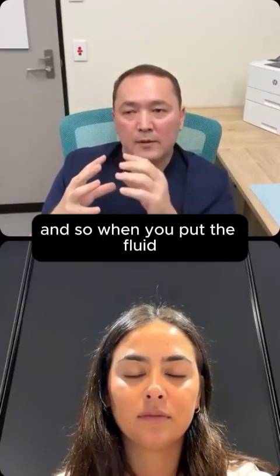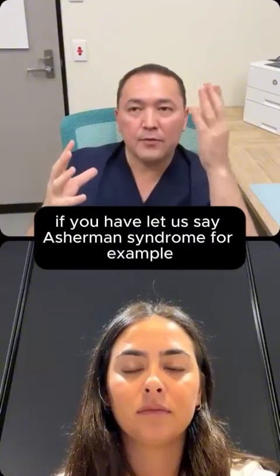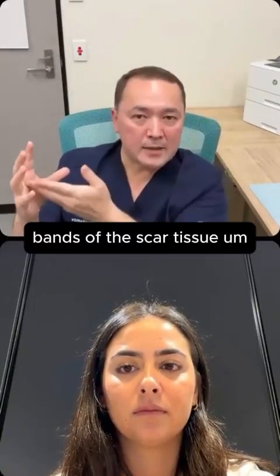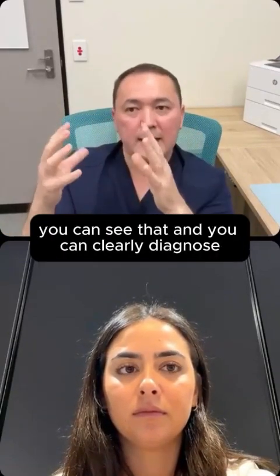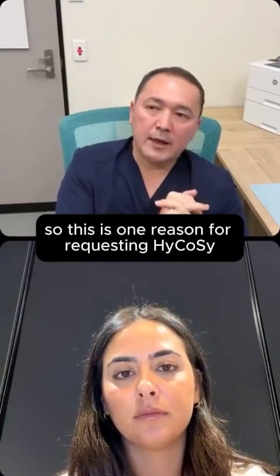So when you put the catheter and put the fluid in, you can see the cavity. If you have, let us say, Asherman syndrome, you can see the dividing bands of scar tissue in the contrast of the fluid, so you can clearly diagnose. So this is one reason for requesting HyCoSy.